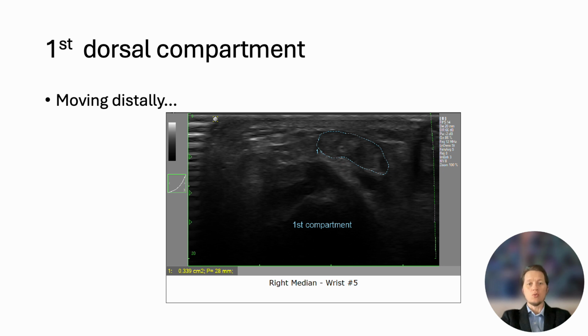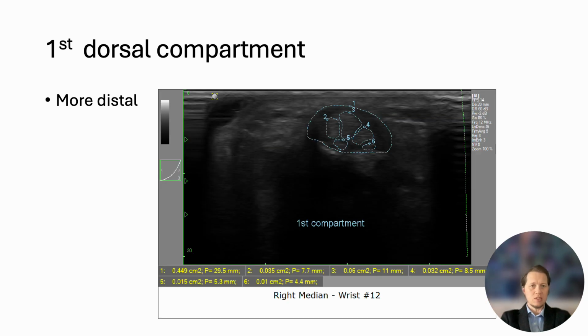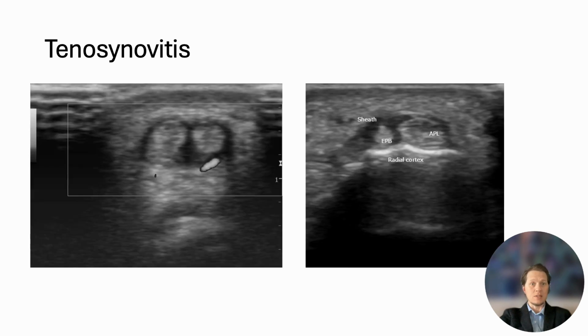Moving distally, it starts to widen, and then we start to see specific pieces and divisions. The tendons are starting to, well, break in half here. And if you continue distally, now we got a bunch of pieces of tendon. So this looks like a mess.